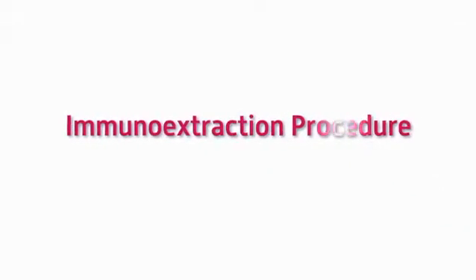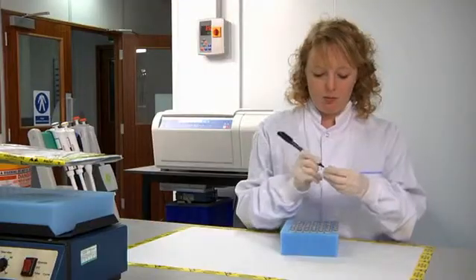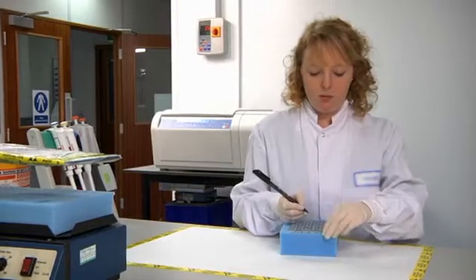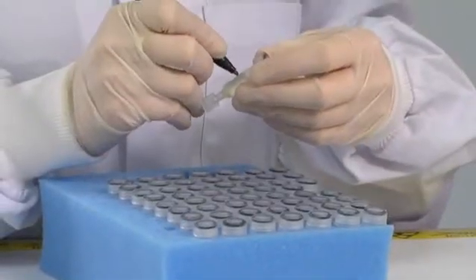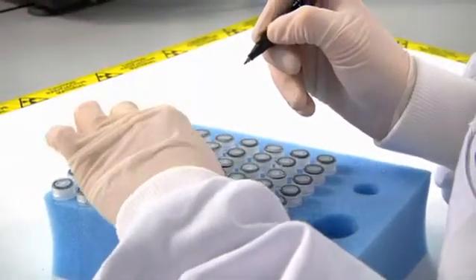Immunoextraction procedure. Step 1: Prepare labeled immunocapsules, two for each control and sample. Do not label immunocapsules for calibrators.